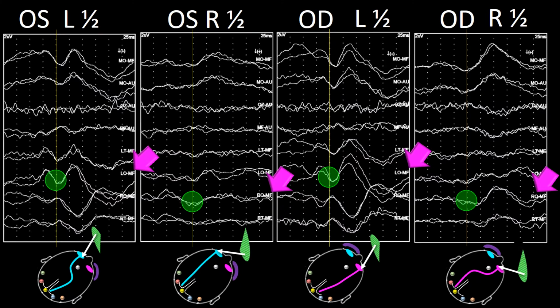The place to look at when trying to determine how are the visual evoked potentials when presented with 4 panels as it was in this question is where those two lines cross, that is where the vertical and the horizontal line cross. In this frame I have represented it by green circles.